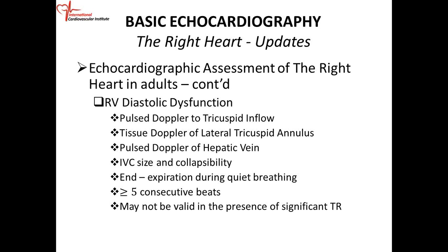On the left side, we look at the pulmonary veins, but on the right side, when you're evaluating the right side, you have to look at the hepatic vein.